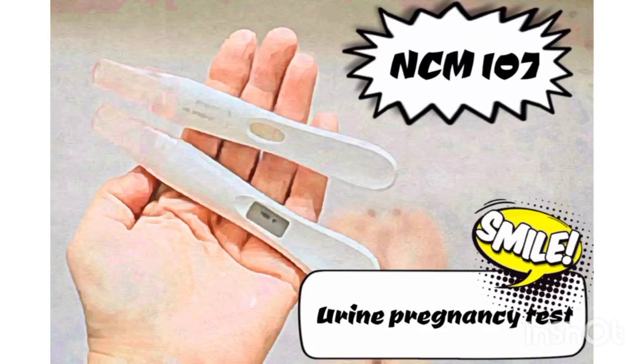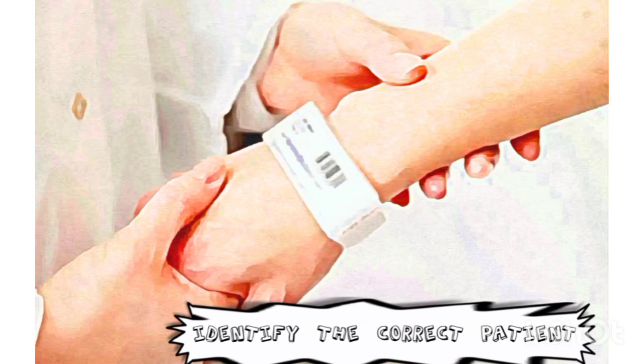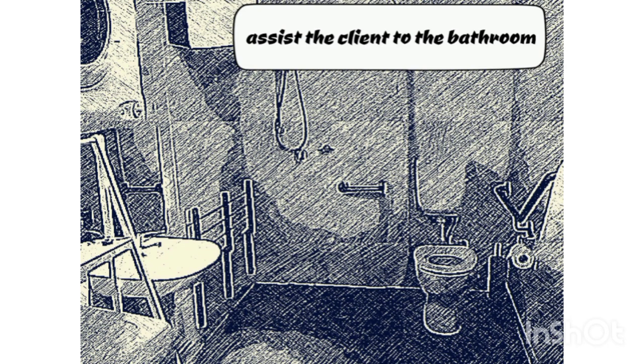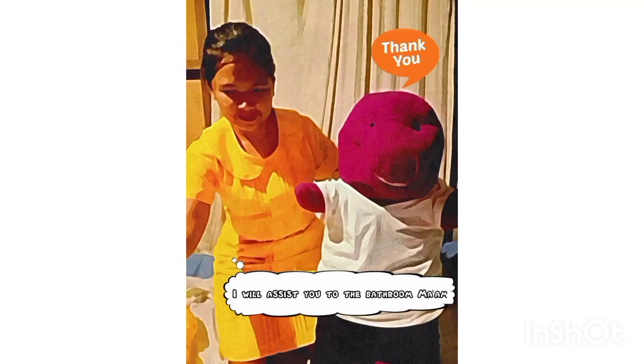Urine pregnancy test. So identify the correct patient and then introduce yourself. Hello, good morning, ma'am. My name is Melana J.D. Molina from Wesleyan University, Philippines. I will be your student nurse for today. Assist the client to the bathroom. So, ma'am, let me assist you to the bathroom.